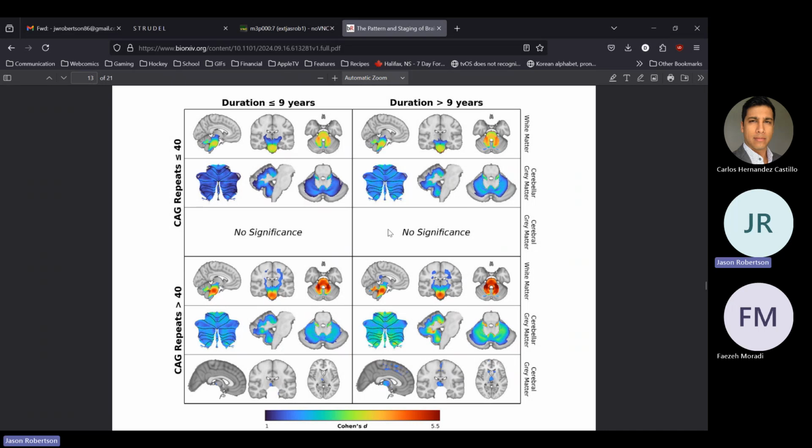And this runs off almost identical code to the one that I showed you earlier for the whole group-wise comparison. The main difference is we took out age and site and used pre-corrected data. But otherwise, everything else is the same.